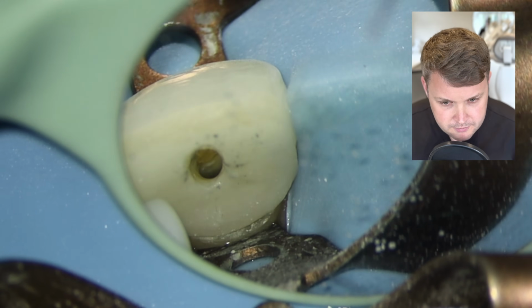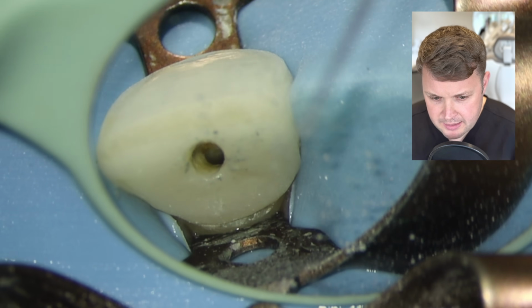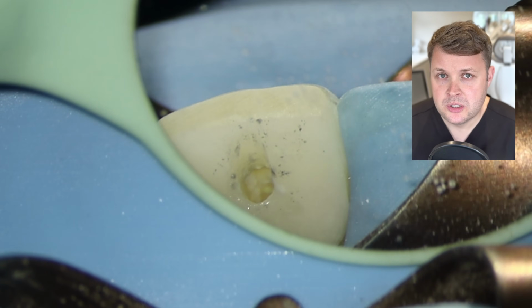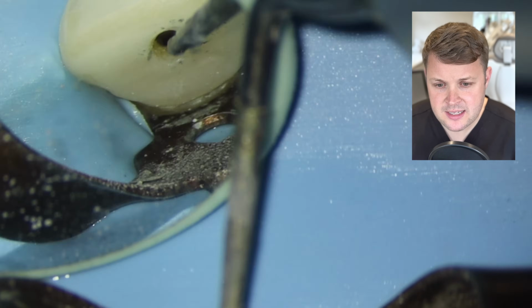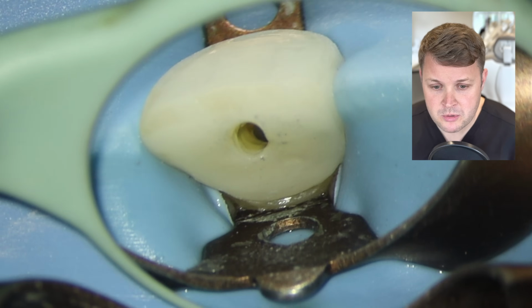And then just checking here with the refinement, I don't want to remove too much of the palatal surface of the crown, but I do want straight line access. So I'm just being very careful. The great thing about these ultrasonics is they're nice and easy, really simple and very slow at removing things.